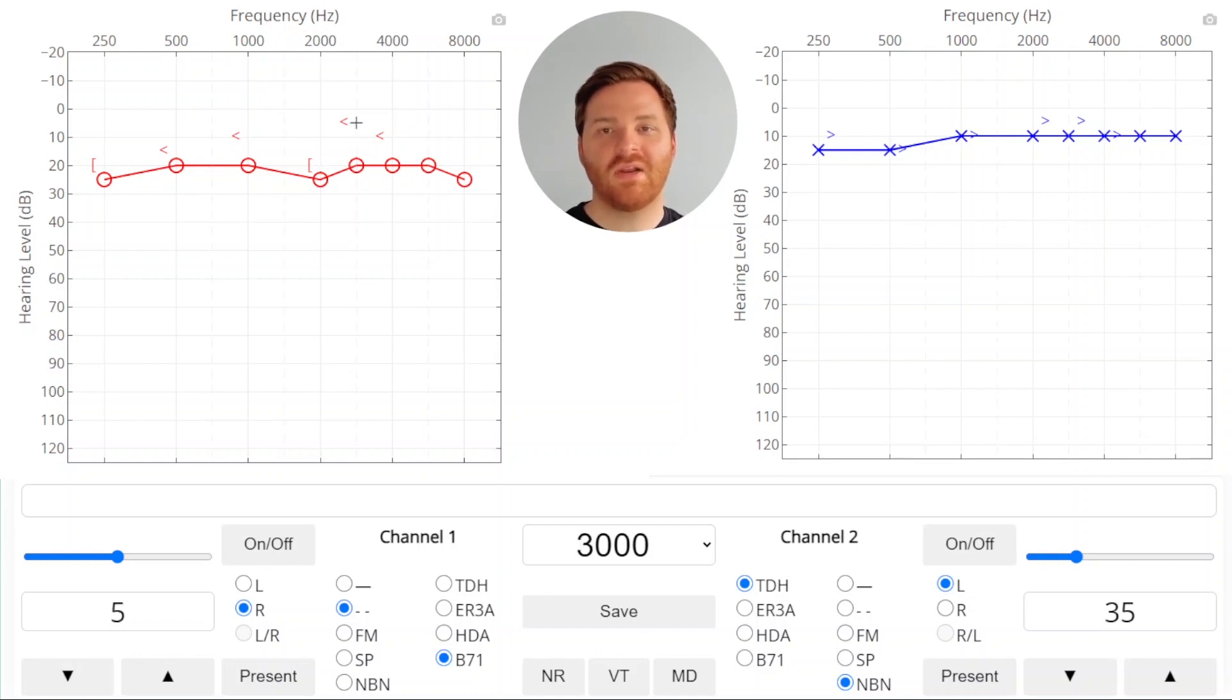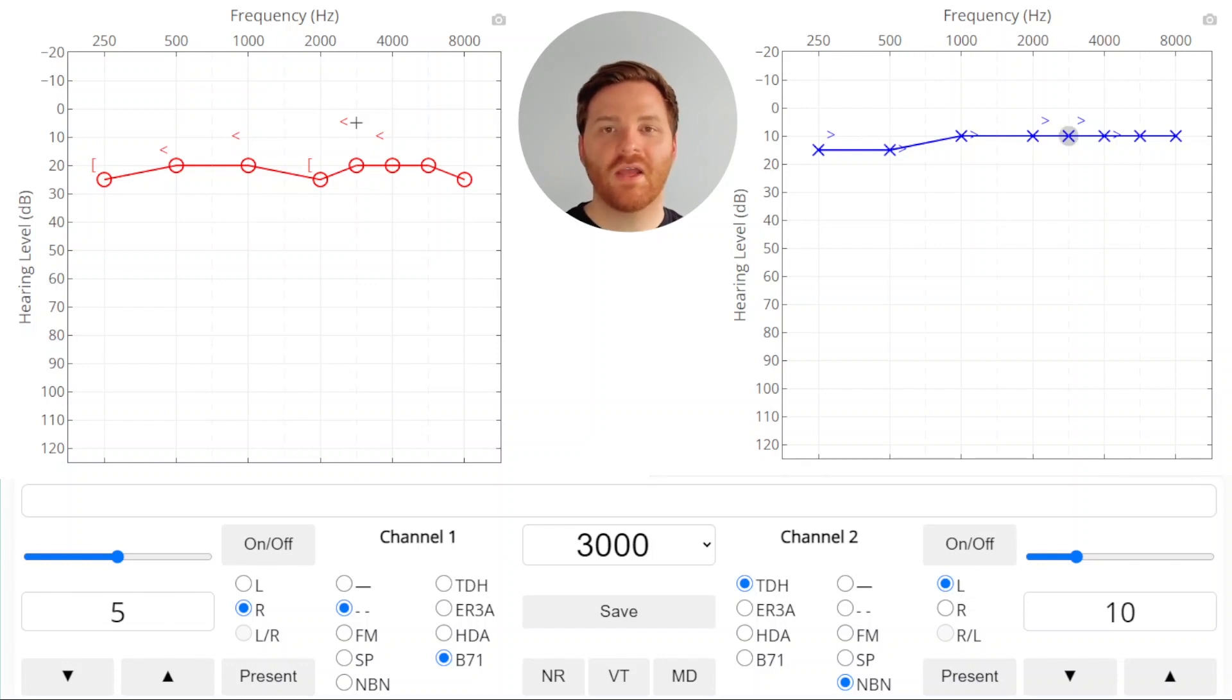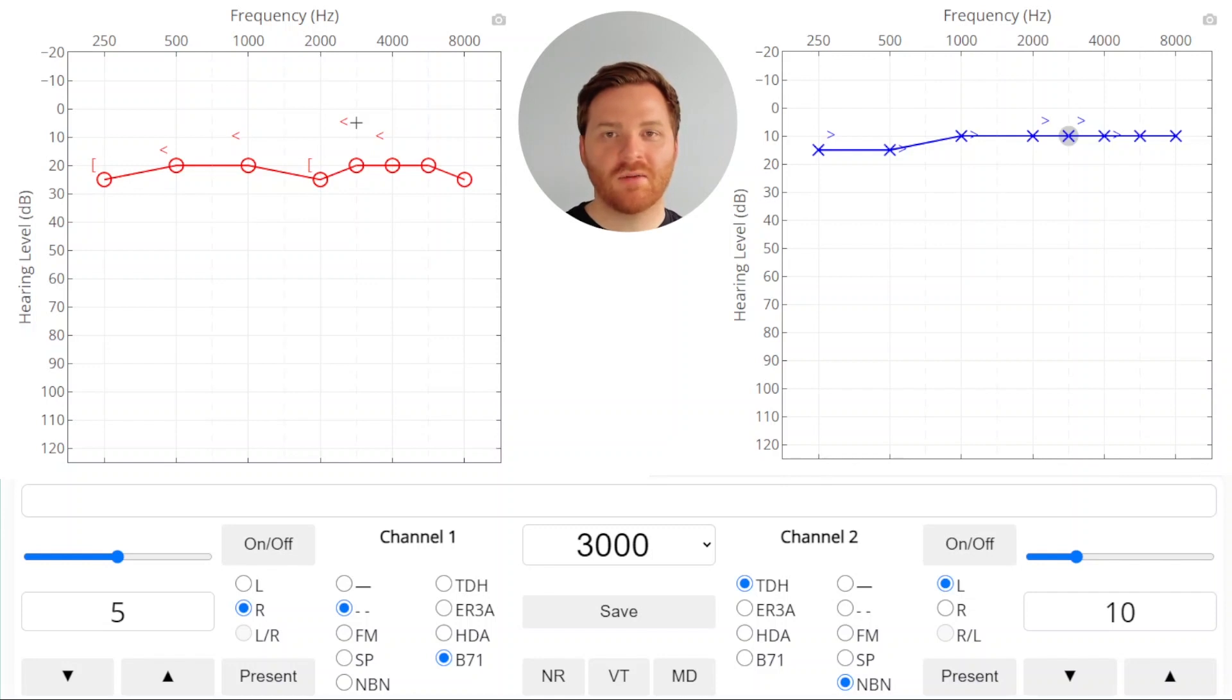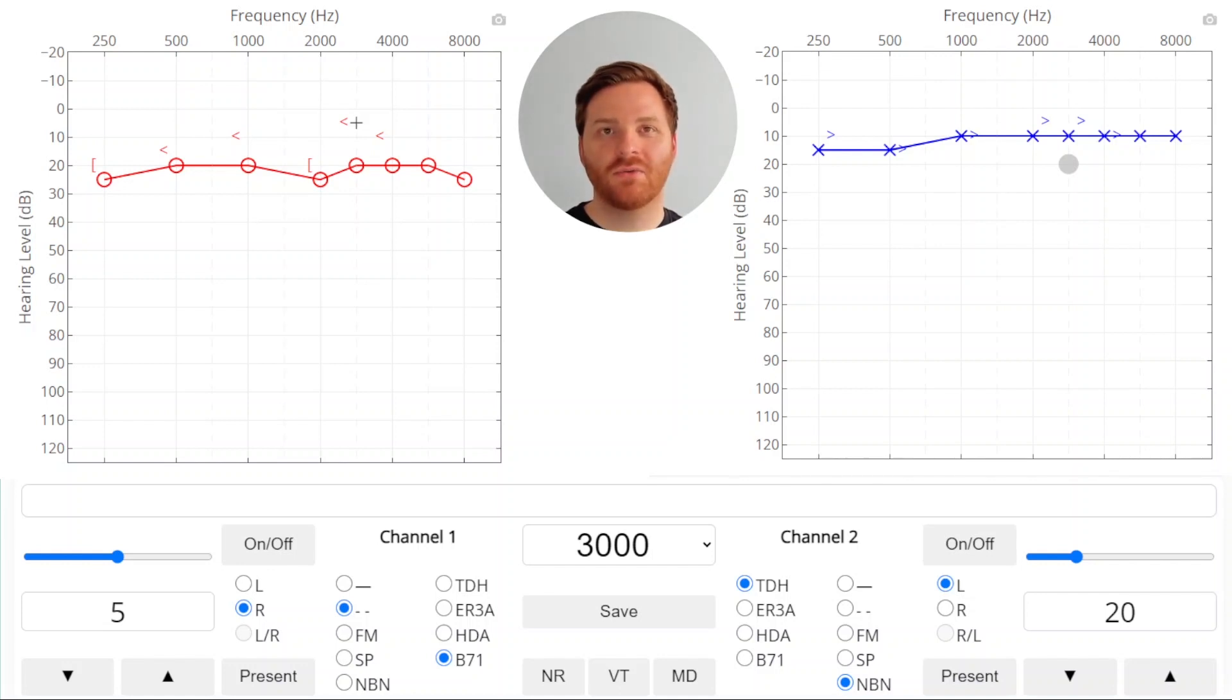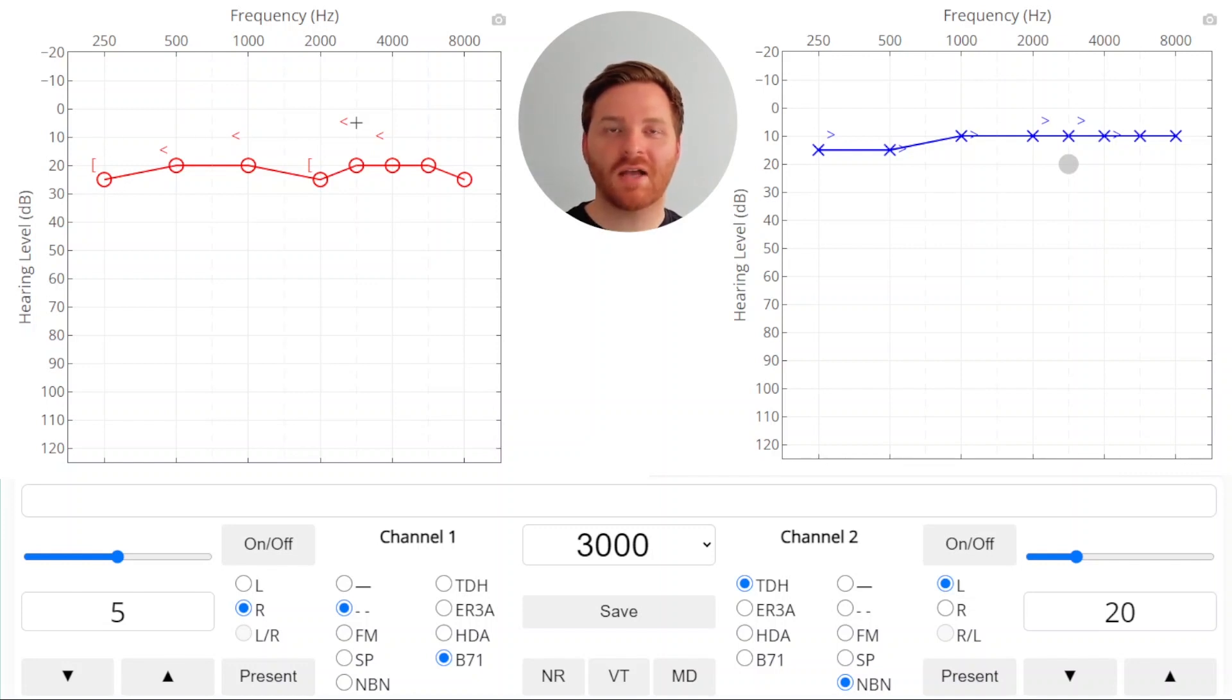The last frequency we need to test is 3000 Hz. We'll turn on our masker, and the masking level is the air conduction threshold of the non-test ear, plus a 10 dB safety pad, plus the occlusion effect. But in this case, we're at a high frequency at 3000 Hz, and so we don't need to add any occlusion effect. We'll present this tone, and we don't get a response. So we're covering up the crossover signal in the non-test ear.